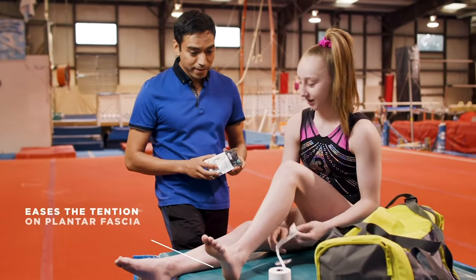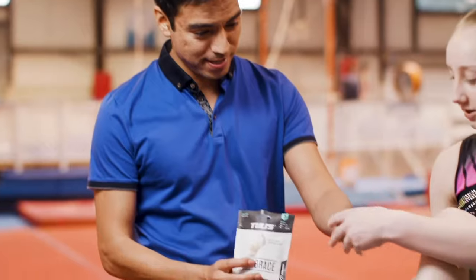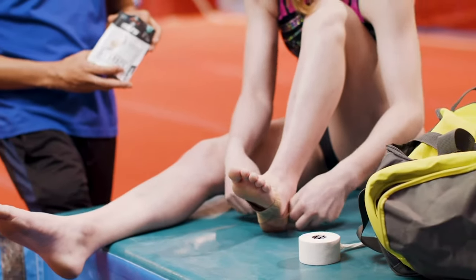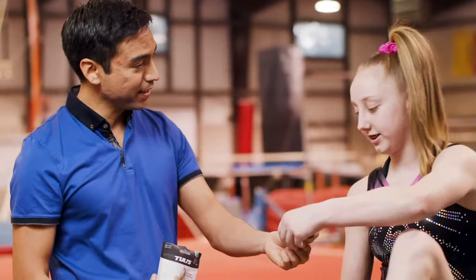It eases the tension and stress on the plantar fascia ligament by limiting the amount of stretching it can do. With a unique patented X-Pattern, this lightweight fabric brace provides support and limits pressure without the time and expertise tape requires.